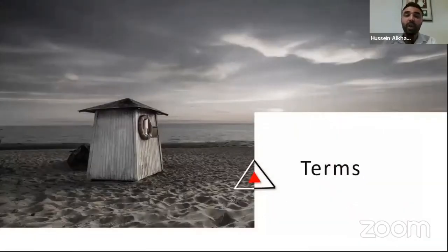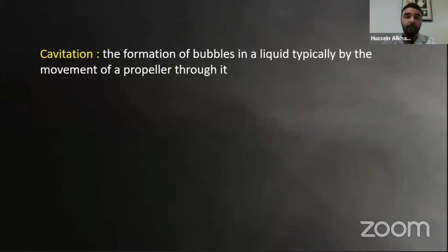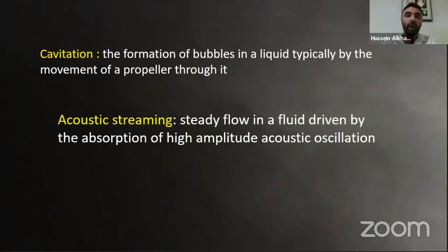Some terms associated with irrigation activation. Cavitation, which is the formation of bubbles in a liquid, typically by moving a propeller through it, while acoustic streaming is a steady flow in a fluid driven by the absorption of high-amplitude acoustic oscillation.